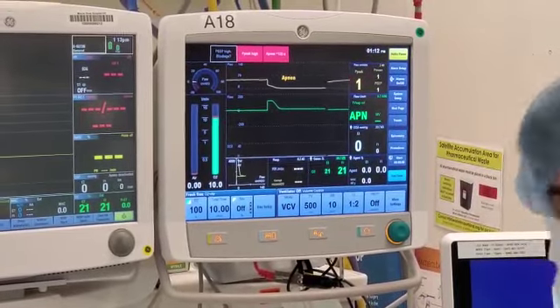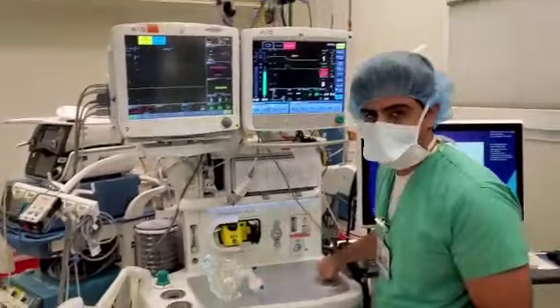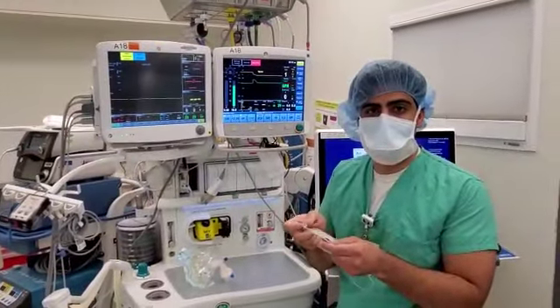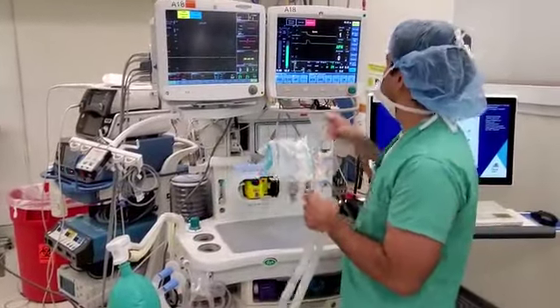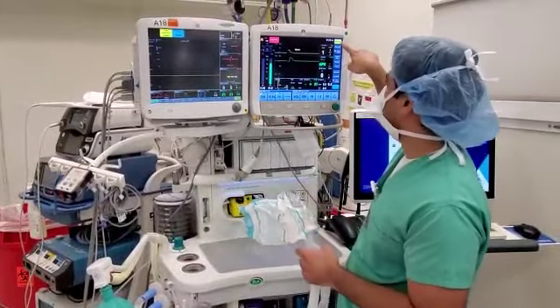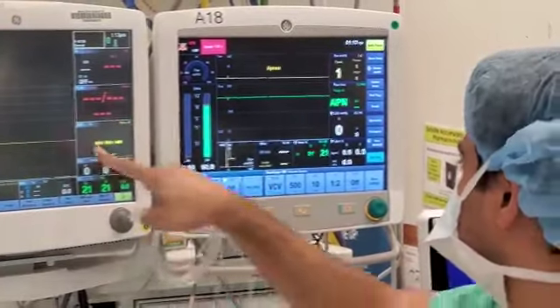So you can try and troubleshoot in terms of what's going on. Hopefully this was helpful. Oh, one more thing, sorry, that I forgot is where to attach your end-tidal CO2 monitoring for the patient. I will pause this real quick, and you can just audio pause up here, or a silence button down here for the alarms for this side.